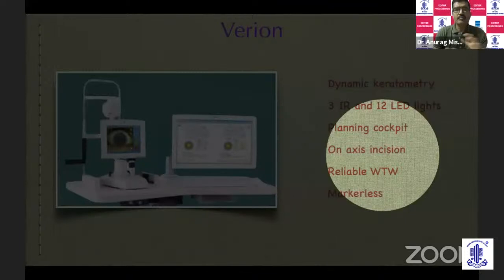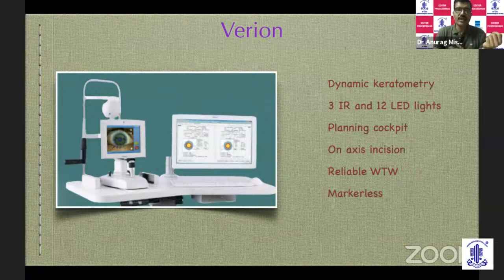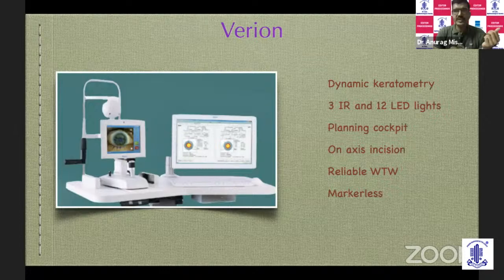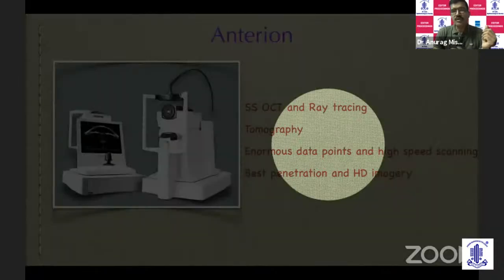And finally, combining all these platforms, the new warrior that has descended on the Western Front is Heidelberg Engineering's equipment called Anterion, which the patient has to go through in my setup for the final testing. It combines both swept source OCT and ray tracing technologies. It is a tomographer, however, you can take in the central corneal readings as well. 16,000 data points are analyzed before giving you the keratometry in this case, and all those are OCT pieces.